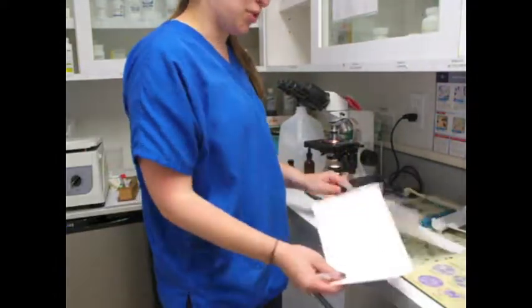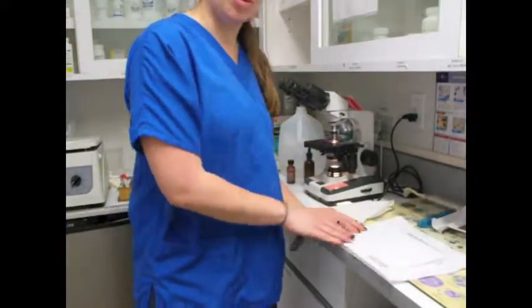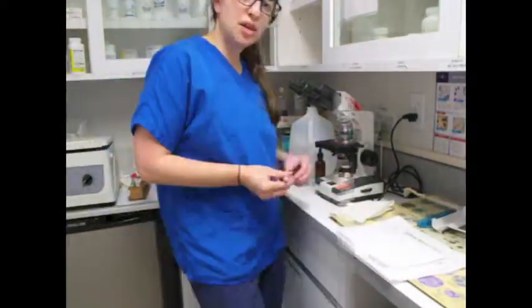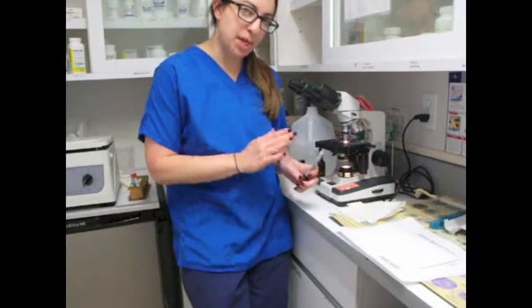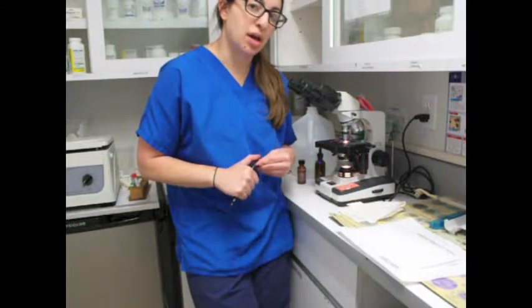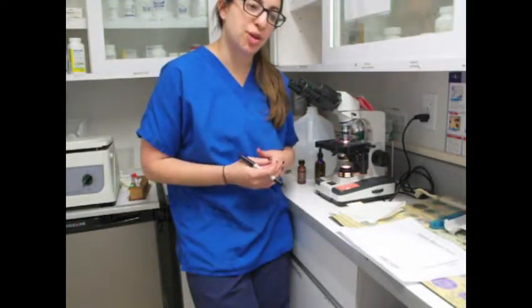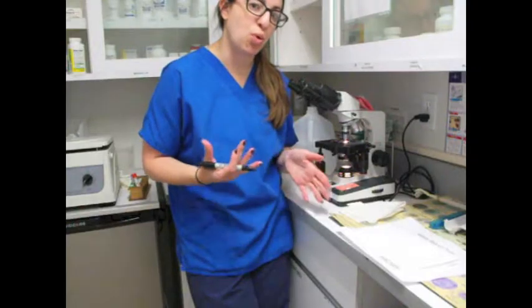So what I'm first going to do is I'm going to start taking my differential. So I'm now going to begin counting my white blood cells on the side. So how we do this is we count, you want to in total count 100 white blood cells. You're going to count 10 per each oil immersion field.